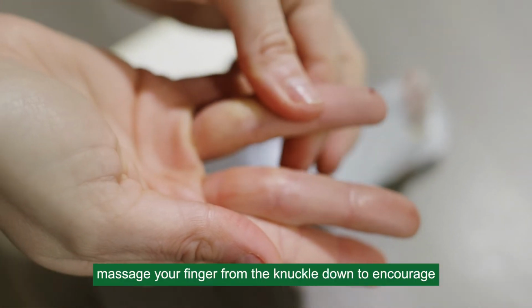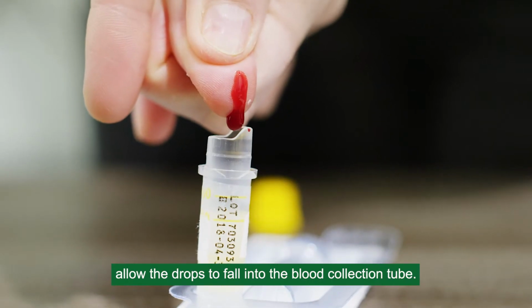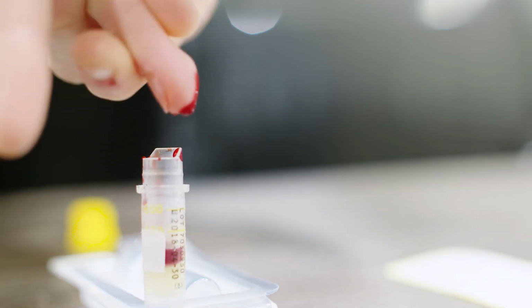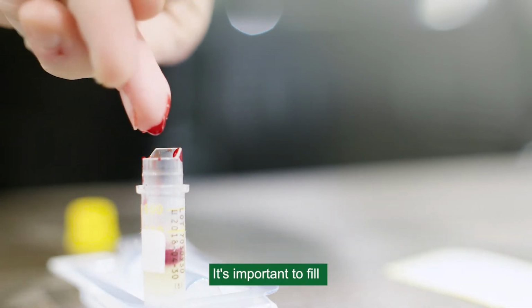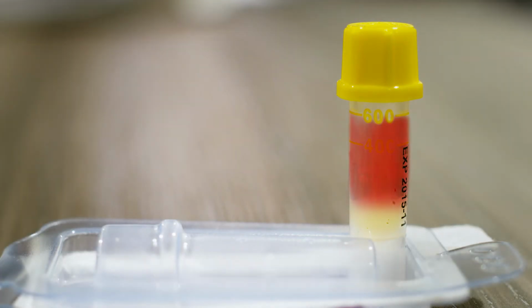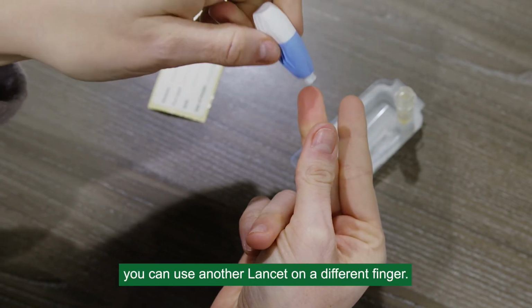Massage your finger from the knuckle down to encourage the blood flow. Allow the drops to fall into the blood collection tube. It's important to fill the blood collection tube to the upper line on the side of the tube. If you're struggling to get enough blood, you can use another lancet on a different finger.